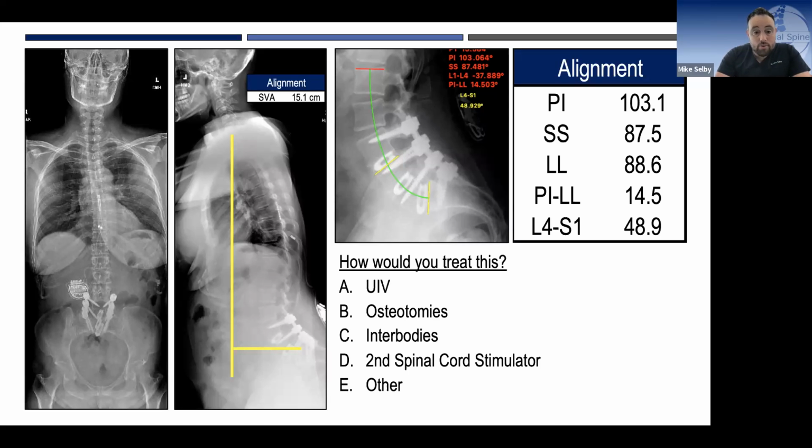Looking at habitus, not the smallest patient out there, so there will be a bit of stress on the instrumentation. And when I look at your full-length sagittal film, she's doing a bit of that water skiing kind of thing. So her alignment SVA may actually be worse than what you're seeing there. She's holding herself up on the X-ray. So we're dealing with a fairly substantial problem here.